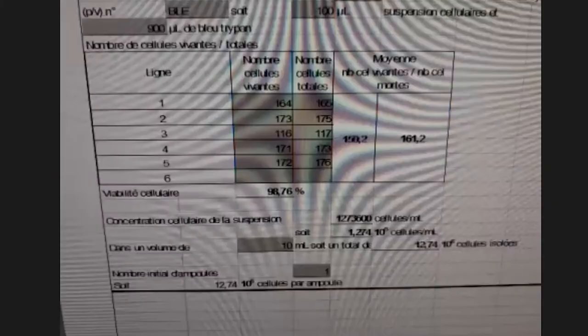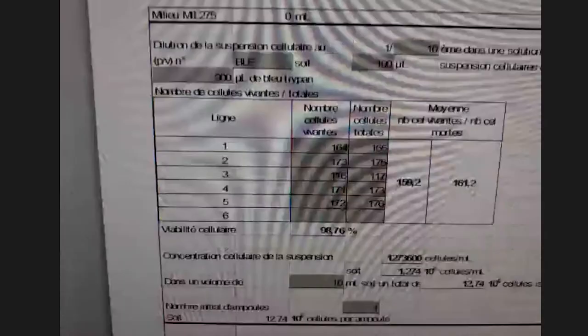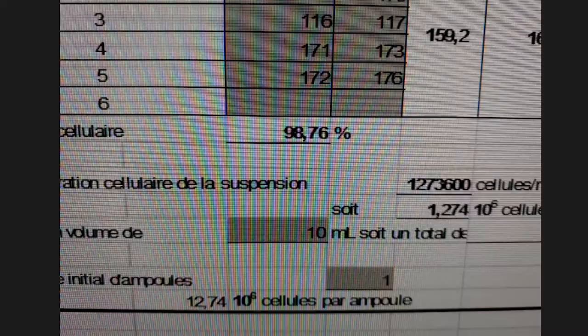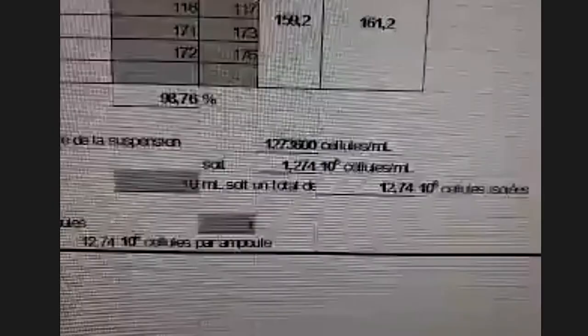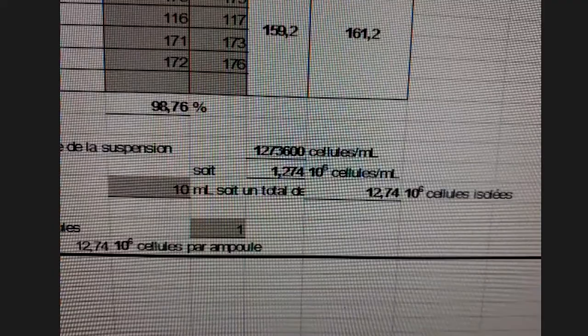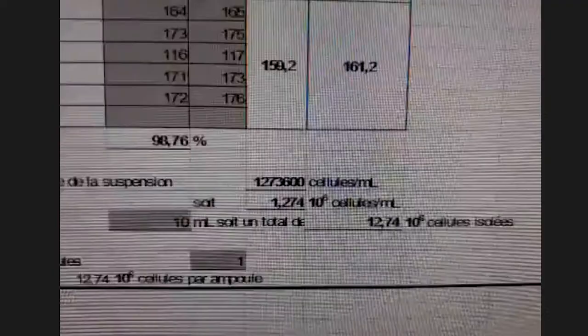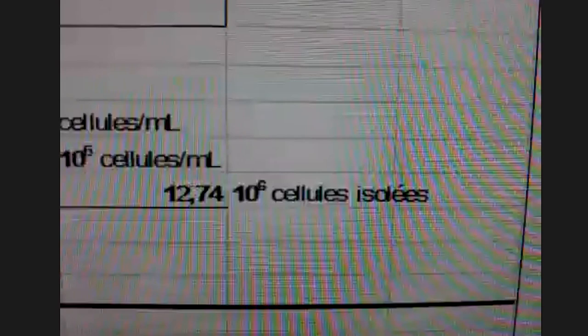On a compté cinq lignes — comme dit au labo, plus vous comptez, mieux c'est, mais faute de temps on s'est contenté de cinq. On a une viabilité de 98%, ce qui est excellent, and the cell viability is 98% which is great.